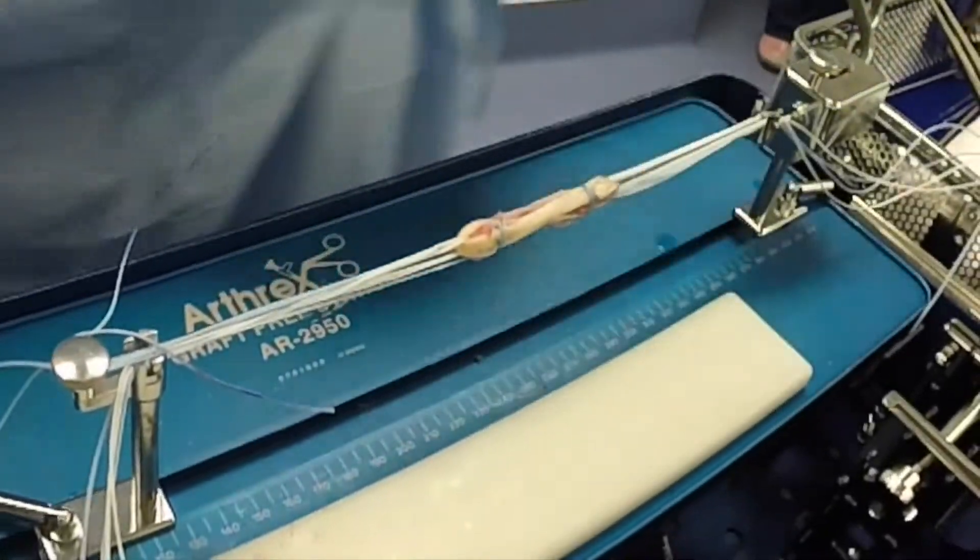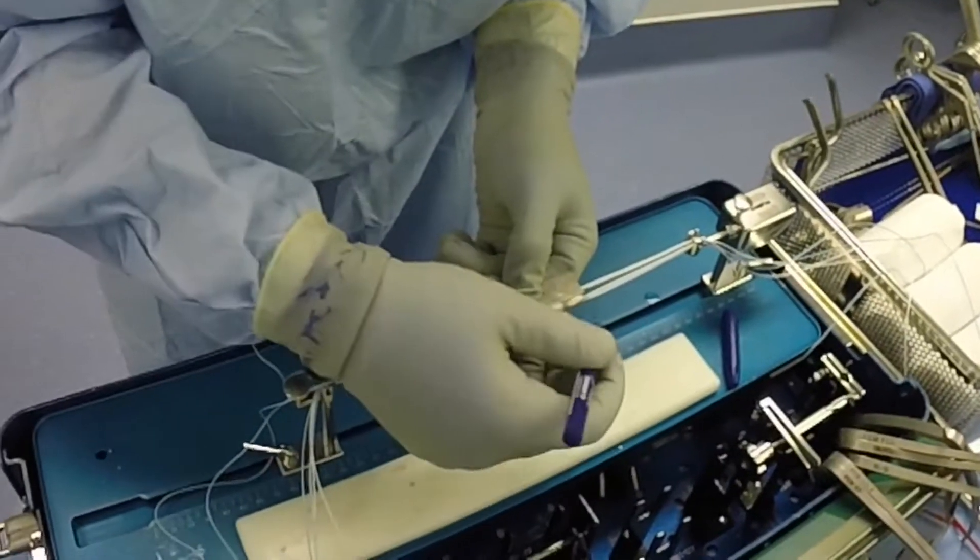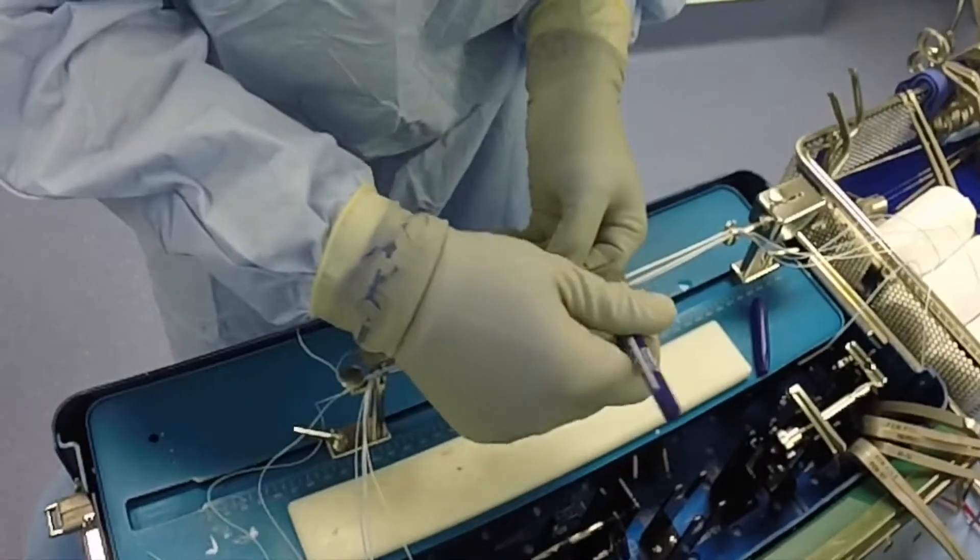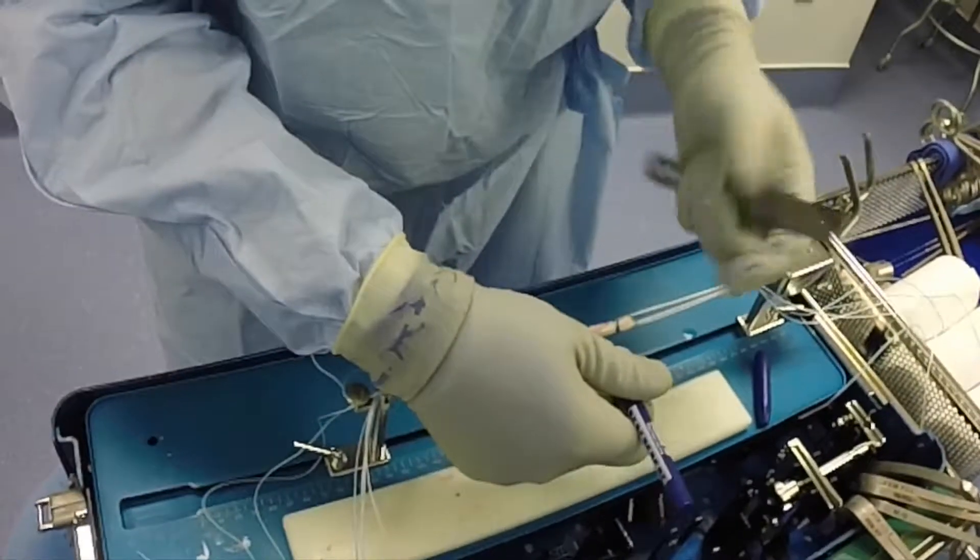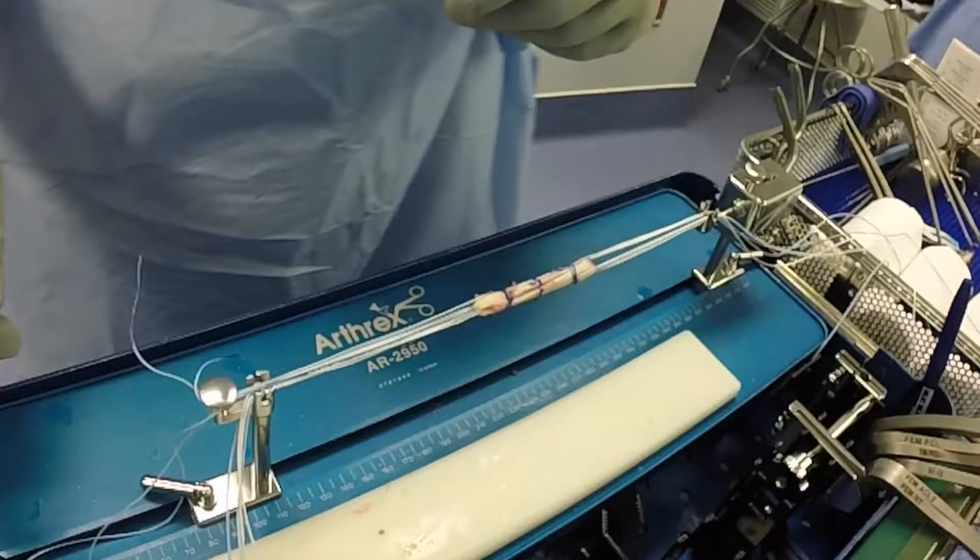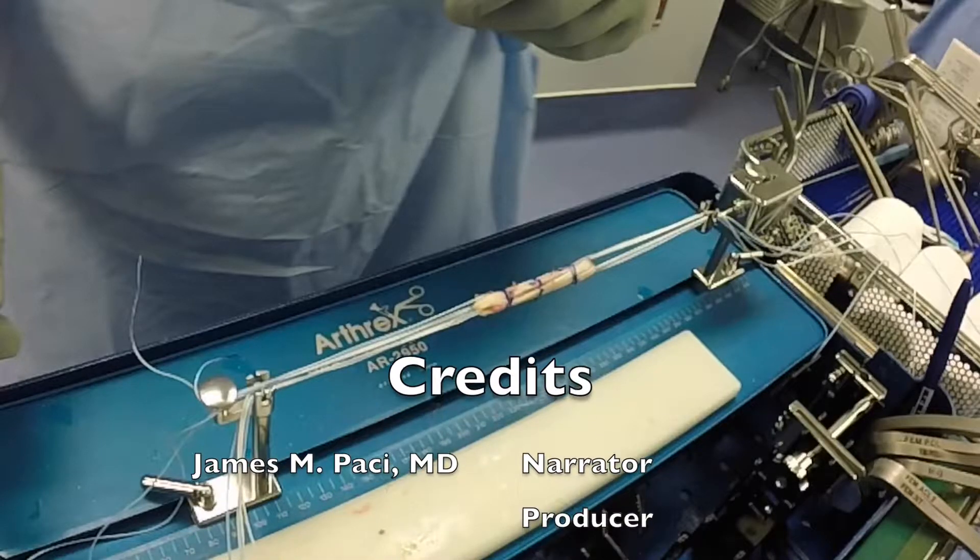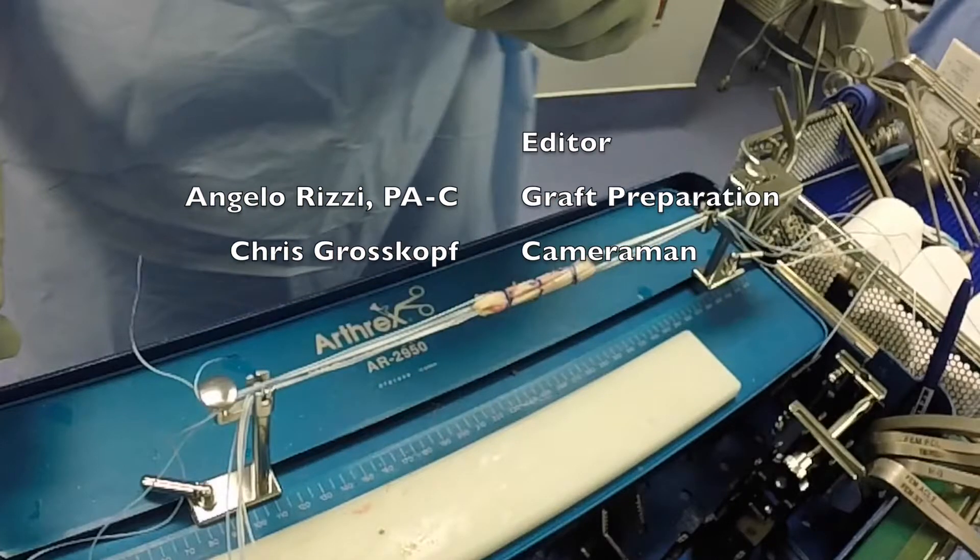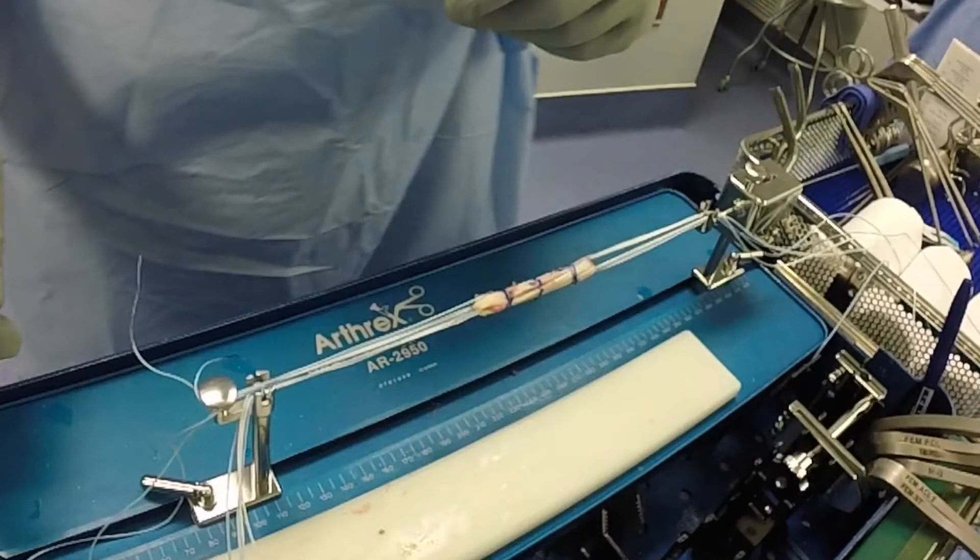And here you have your final graft. It's tensioned at 10 to 15 pounds. We then mark the graft generally at 15mm from each end and then at the central portion, what we call the 50-yard line, which can subsequently be referenced when tensioning and placing the graft intra-articularly.